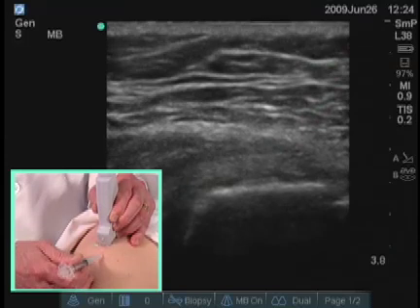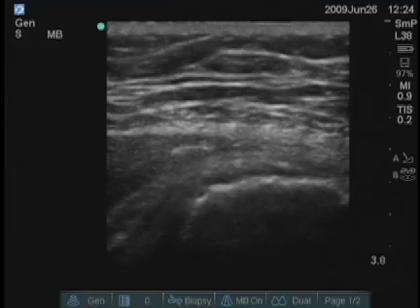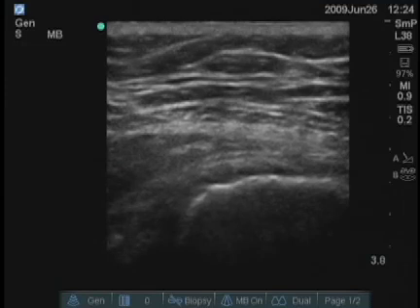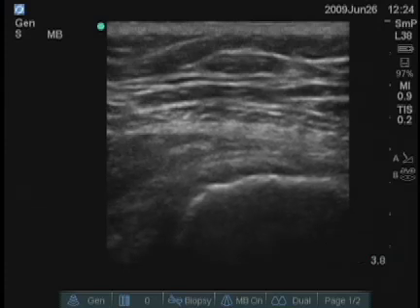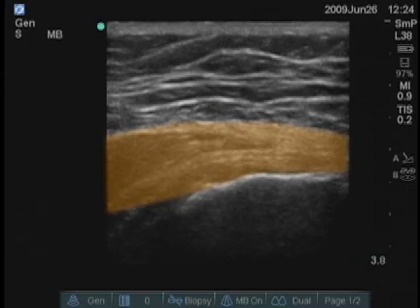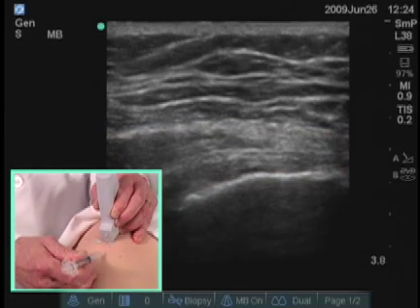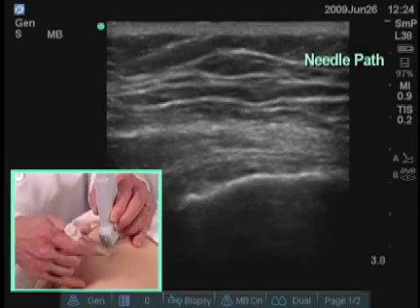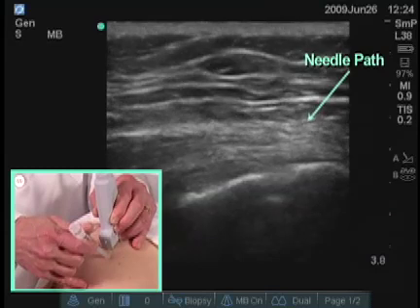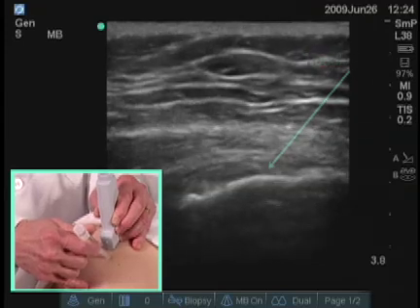Sometimes it's better to be a little distance away from the edge of the transducer. By looking at the screen, you can see that the depth of the marker is nearly 4 centimeters, and the surface where the tendons are and the bursa is down about 2.5 to 3 centimeters. So I'm going to have to get an angle that gets this down to the depth, and the angle will be changed by me as I enter the skin to direct the tip into the structure that I'm aiming for.